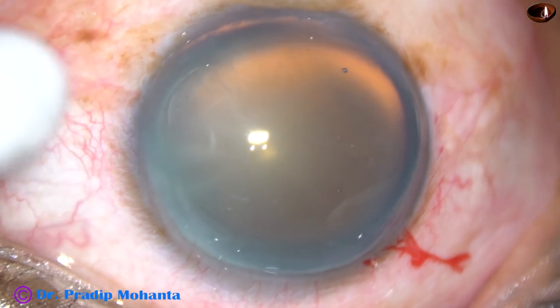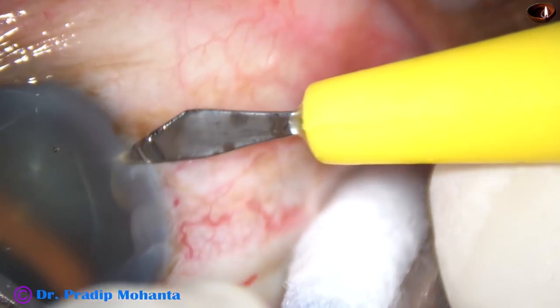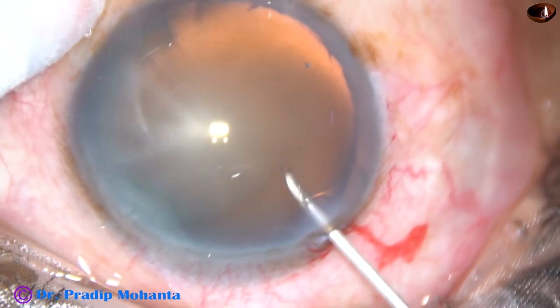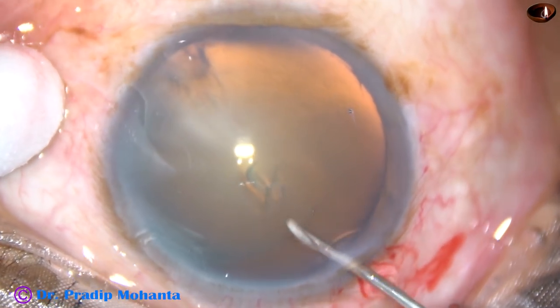By this time, the main incision has been made. I tried to do a sideport, but this knife is not sharp. So I take a 26-gauge needle, incise the anterior capsule and raise a flap.